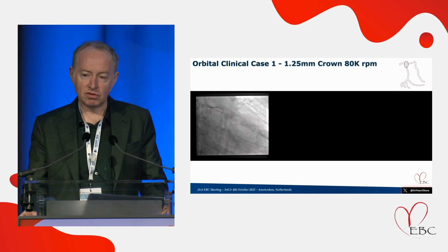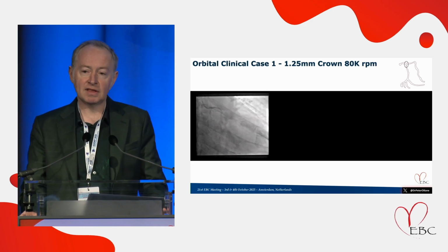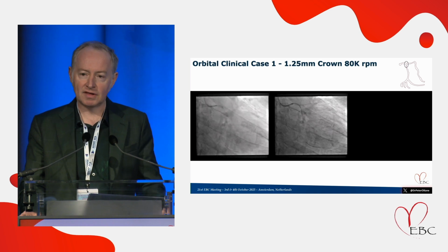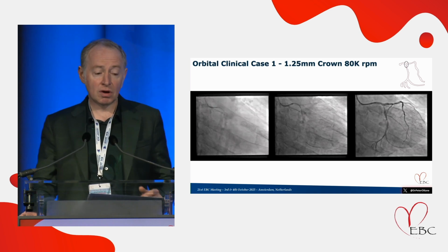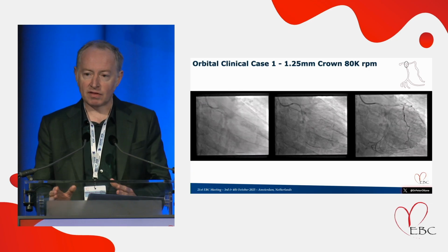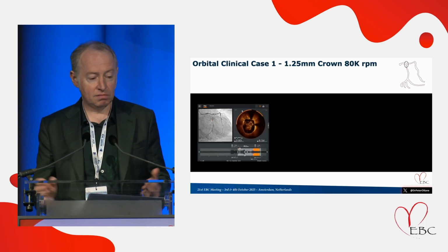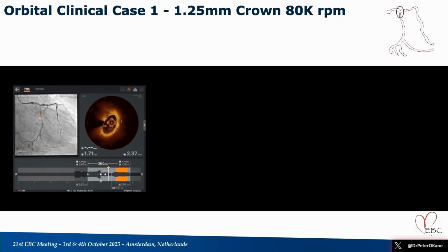I just think that probably reduces the risk of perforation, but also it might make it more effective because you're actually targeting that more eccentric plaque. And it will work both at shaving and also perhaps more deeply at trying to crack those deeper plates of calcium. So it could be a device that suits everything without needing to combine.